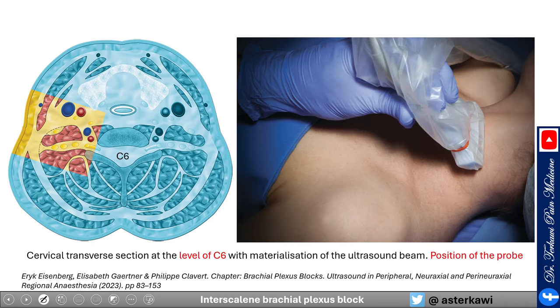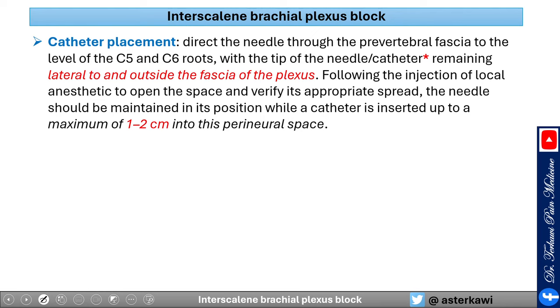At the C6 level, note the probe and patient position. For catheter placement, direct the needle through the prevertebral fascia to the C6 nerve root, with the tip remaining lateral and outside the fascia of the plexus. After injecting local anesthetic to open up the space and confirm appropriate spread, maintain the needle position while inserting the catheter one to two centimeters into the space.